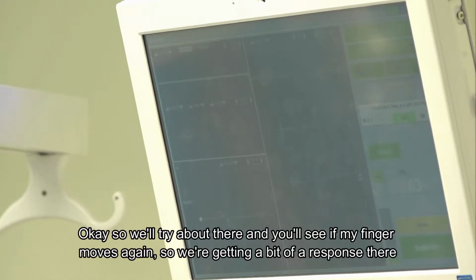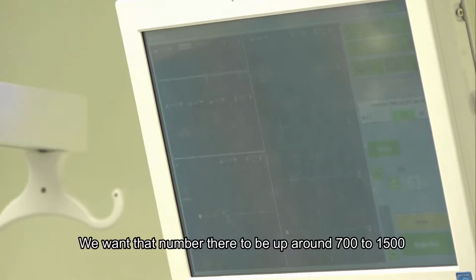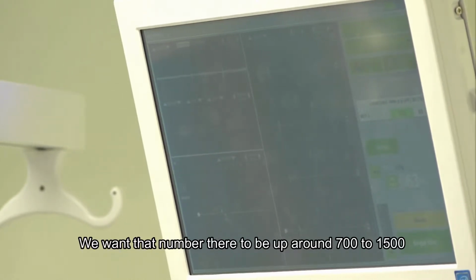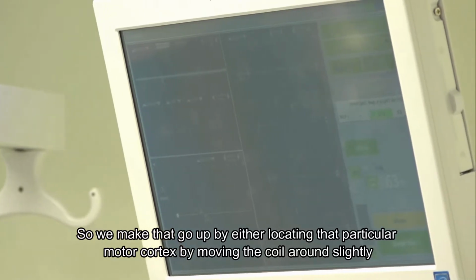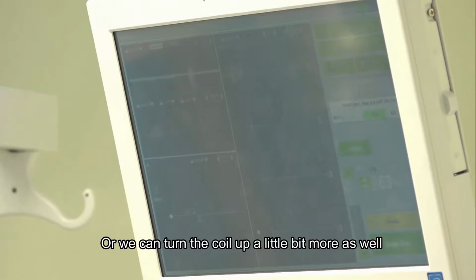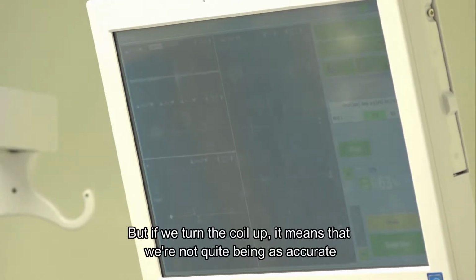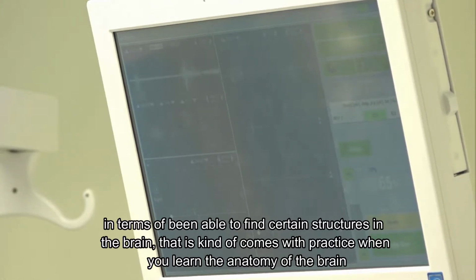Okay, so we'll try about there. And we'll see if my finger moves again. So we're getting a bit of a response there. So you see that number there, it says 152 that's highlighted in green. We want that number there to be up around 700 to 1,500. So we make that go up by either locating that particular muscle in the motor cortex by moving the coil around slightly, or we can turn the coil up a little bit more as well. But if we turn the coil up, it means that we're not quite being as accurate in terms of being able to find certain structures in the brain, that kind of comes with practice when you learn the anatomy of the brain.